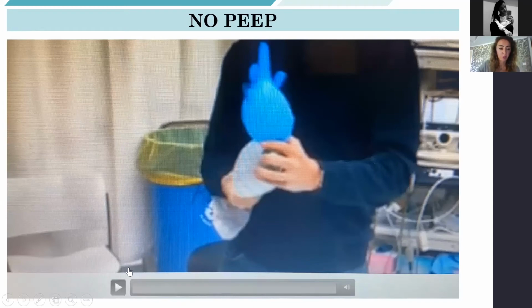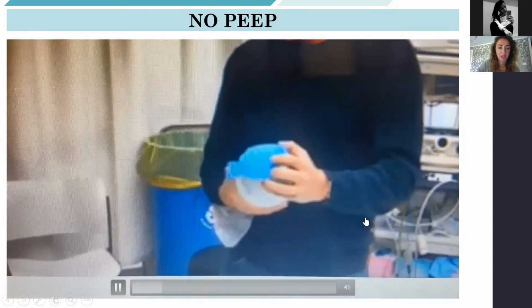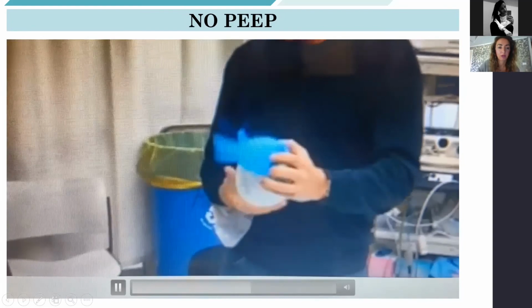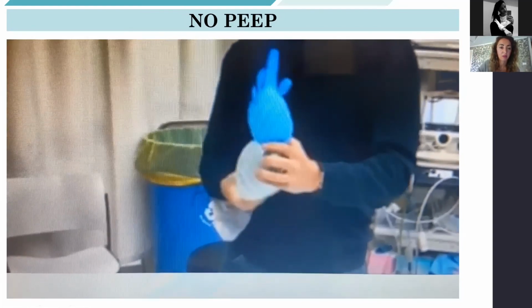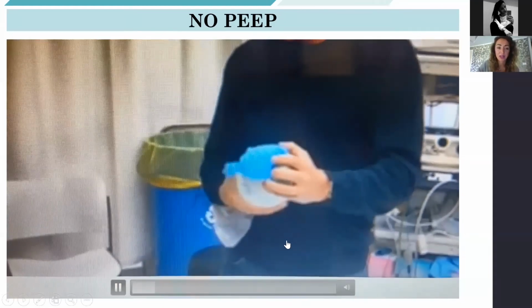In this boomerang video, I would like to show you how PEEP actually works. Please play, Michelle. Thank you. So you see, here we have certain amounts of tidal volume with the ambu bag reinflated, and we can see that the gloves or the lungs will be fully deflated.